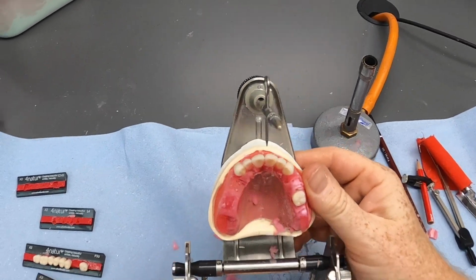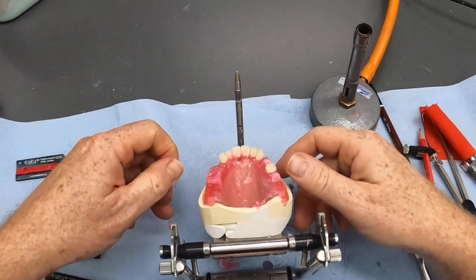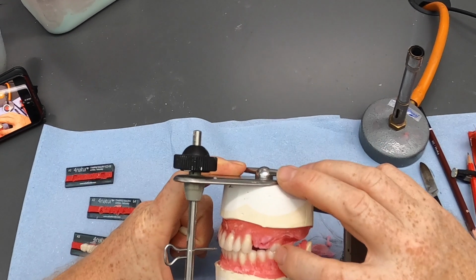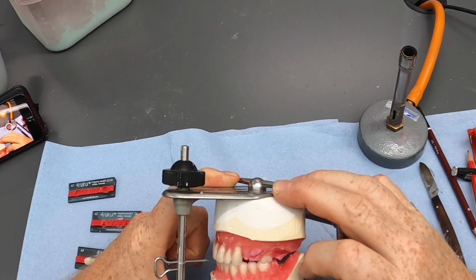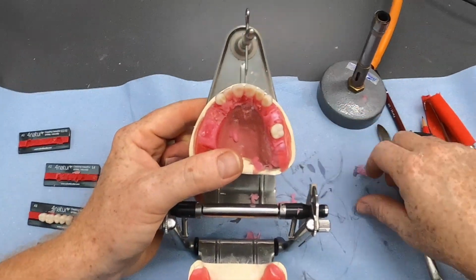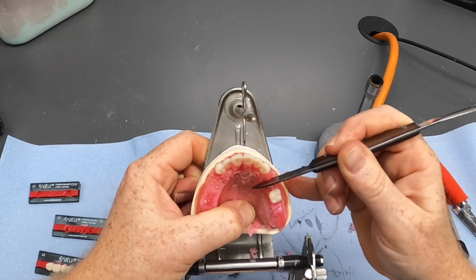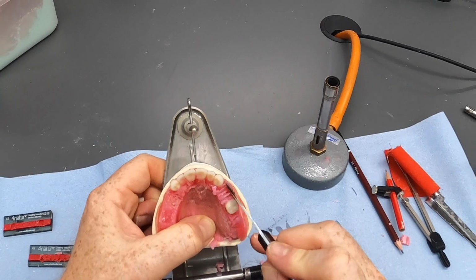Classification for denture teeth is a little bit odd, isn't it? So there you go. We can see that we've got that one lined up now, and we've got the buccal cusp of the upper tooth lined up with that fissure that goes between the buccal cusps of the lower teeth. Hopefully now these premolars, the 5 and the 4, should butt up to the 6 and each other without too much trouble and too many gaps.